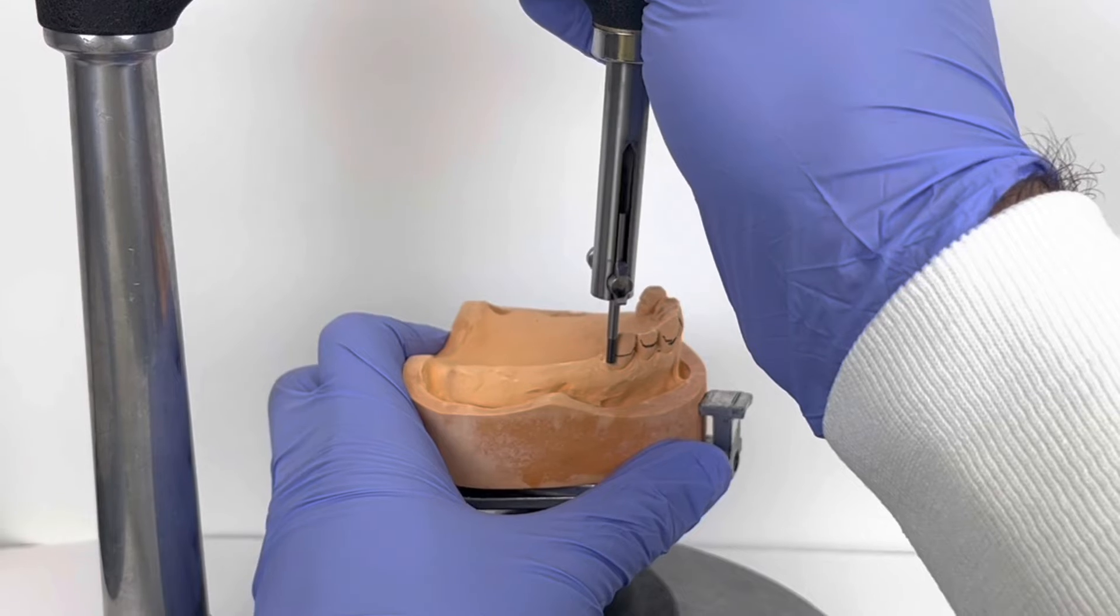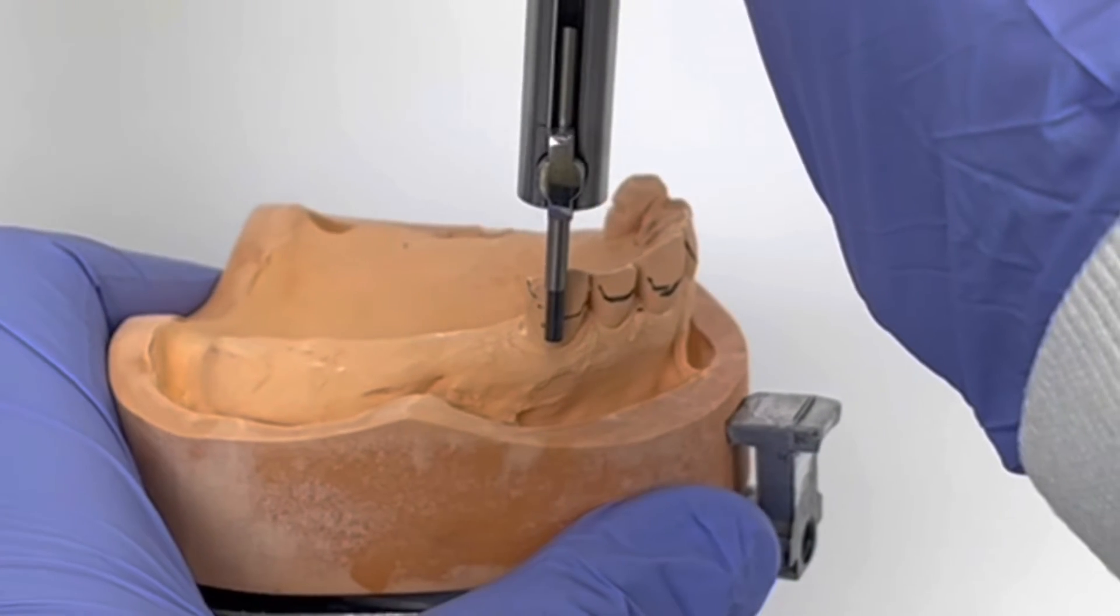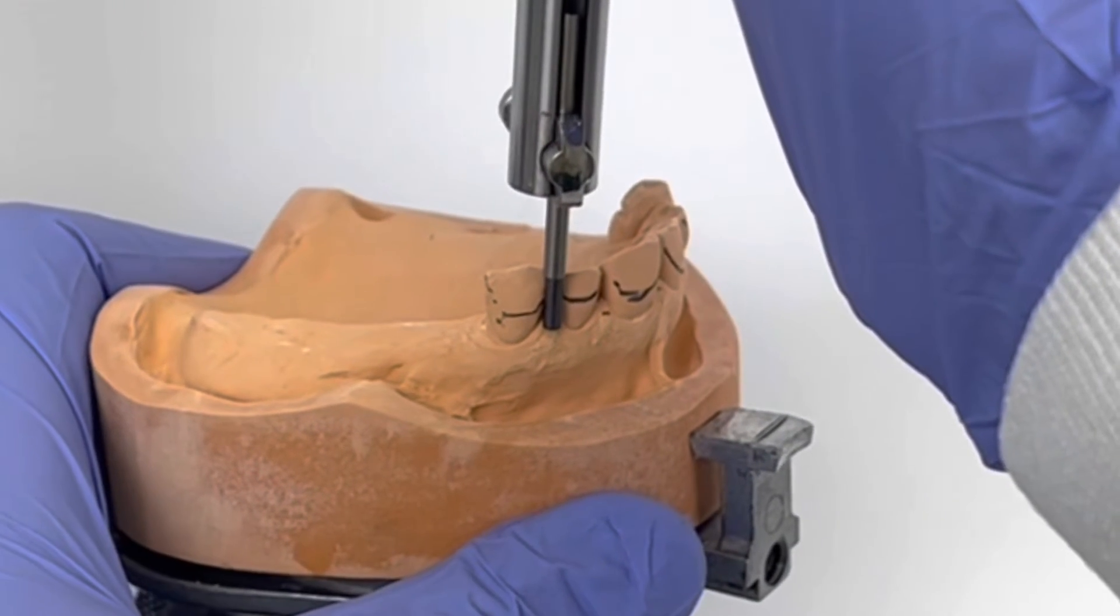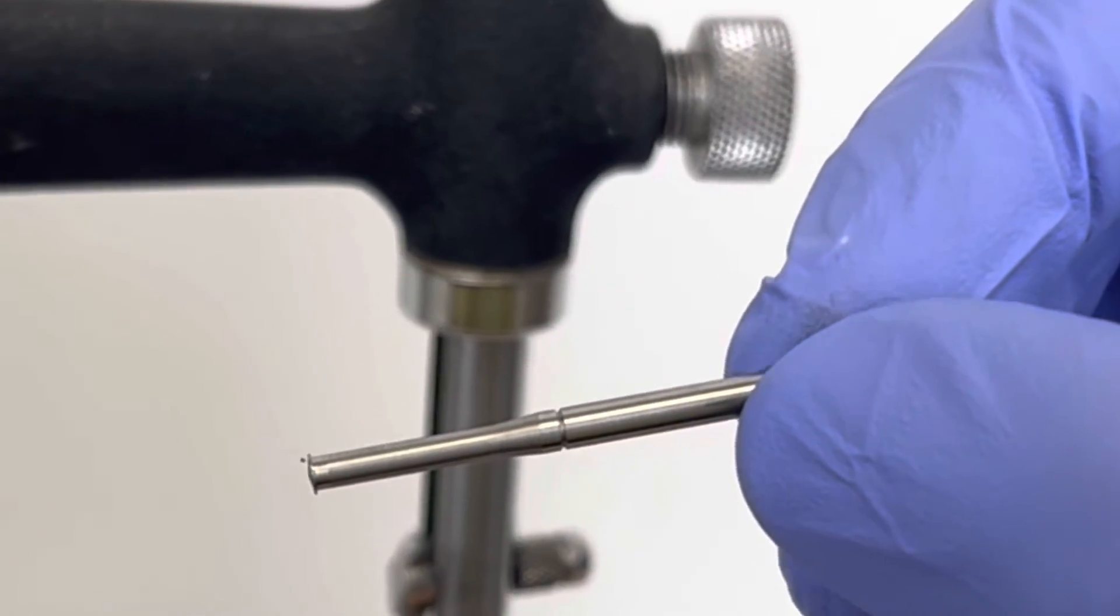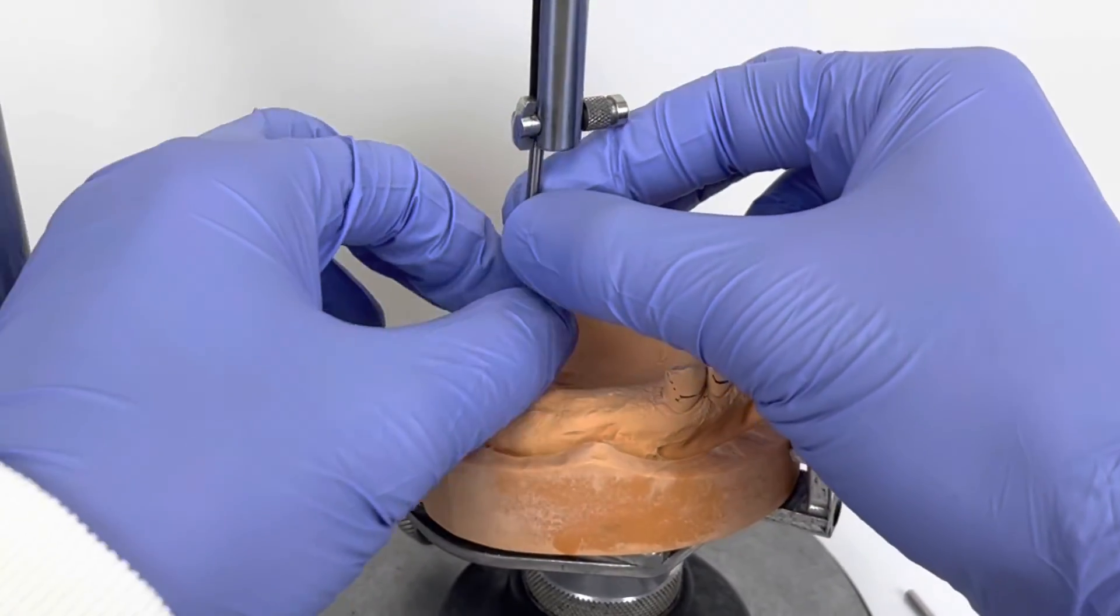It's time to measure the depth of the undercuts. Measuring the depth of the undercuts is done using undercut gauges. This here is a 0.01 inch gauge.